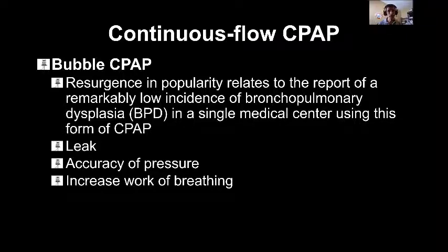However, remember, bubble CPAP, and we will talk about how we can do the bubble CPAP. There are a lot of leaks from bubble CPAP. There are many areas in the system that can leak. And the problem is, you cannot measure the leak. And because it's a manual setting, it's subject to error. And remember when we talked about CPAP and flow nasal, again, we said it's a regulated pressure. It's a pressure that you can measure. And because the measurement of bubble CPAP is not that accurate, this is another problem.